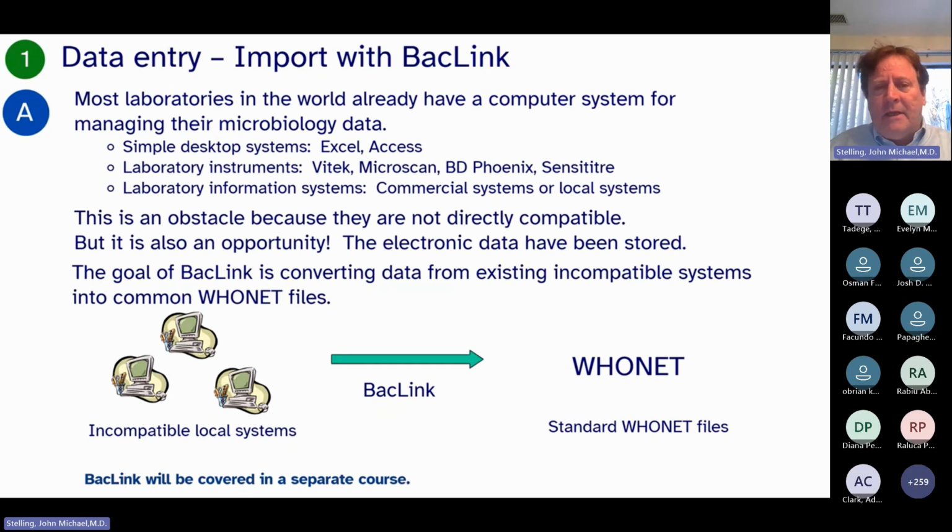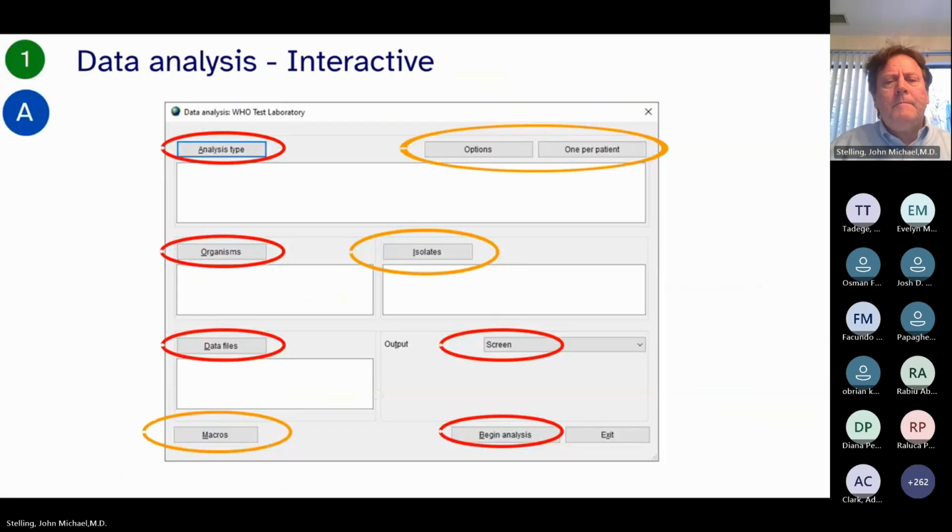If you have data in Excel or a Vitek or a Phoenix or a laboratory information system, once a day, once a week, once a month, you can utilize the BacLink software to transfer the data from your system into WHONET. In this case, WHONET is not your day-to-day system. WHONET is a valuable add-on for data analysis, data sharing, public health reporting.